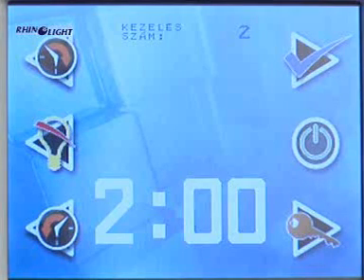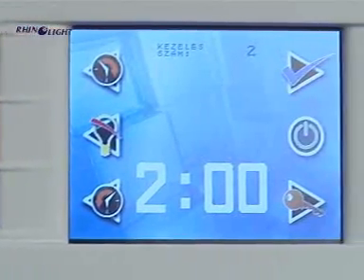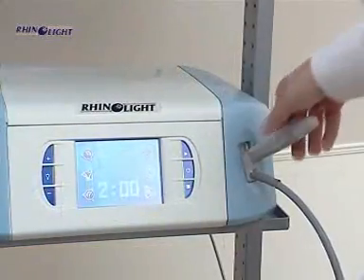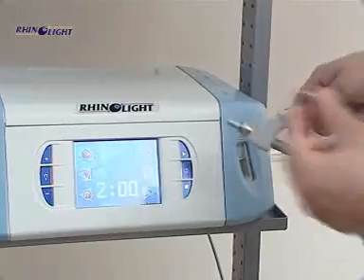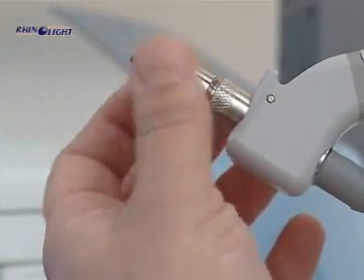The cooling fan of the equipment is switched on as well, and at the same time the numbers indicating the treatment time to be set are shown on the display. Take the treating head out of the holder on the front and put on the nasal attachment. For each treatment, a sterile nasal attachment should be used.